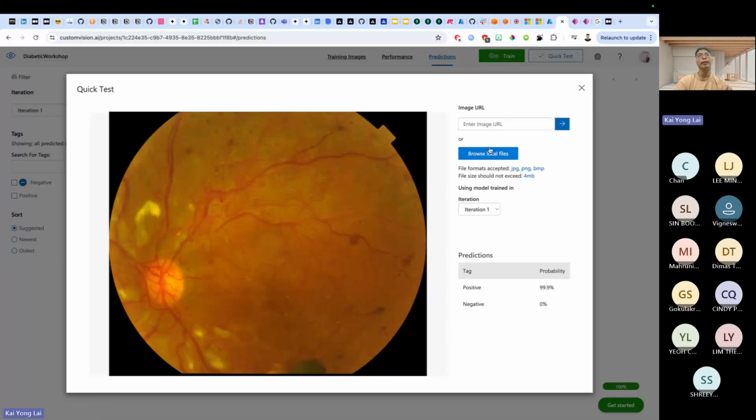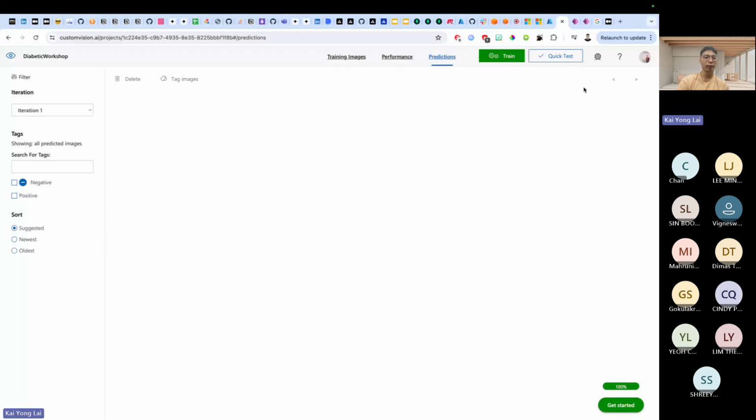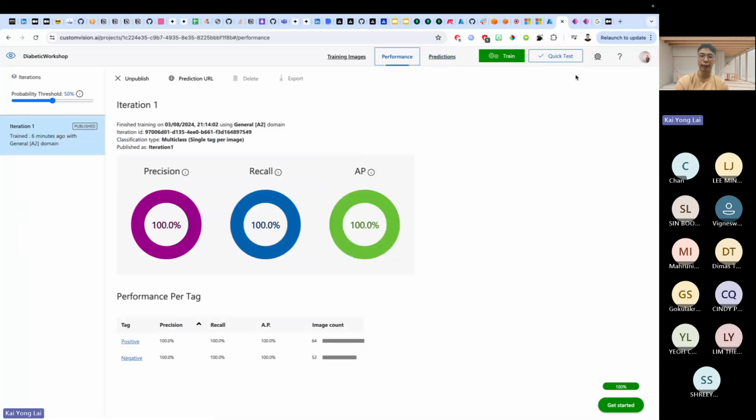Yeah, you can see, DR means that the eyeball is detected to have the diabetic disease. Since we don't have the DR3 data in our training data, now we can use it for the predictions and test whether the model is working well. According to this, once we uploaded an eyeball that actually has the disease, it identified that, hey, 99% I'm confident to say that this eyeball is facing the disease. So it seems like our model is trained well and it can predict confidently and correctly.